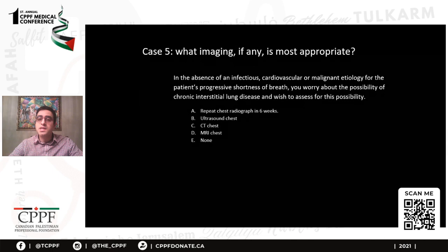So what imaging, if any, is most appropriate? I repeat, chest radiograph in 6 weeks, ultrasound chest, CT of the chest, MRI of the chest, or none of the above. So you have 30 seconds to answer this question. Okay, time is up. So the correct answer at this point is a CT of the chest.